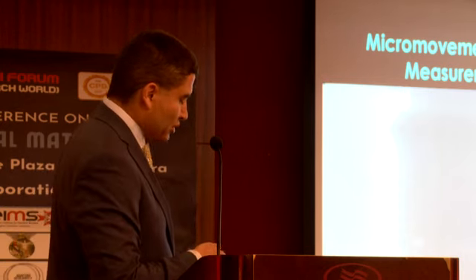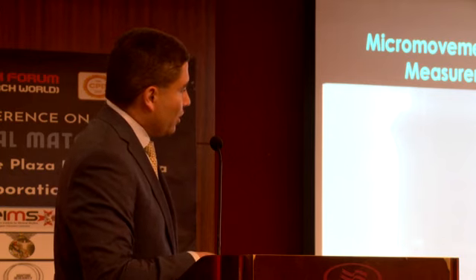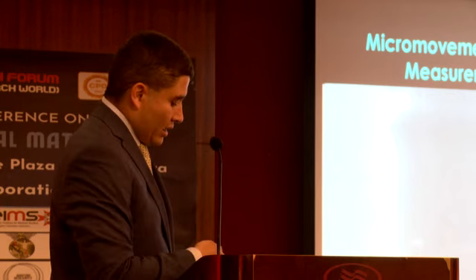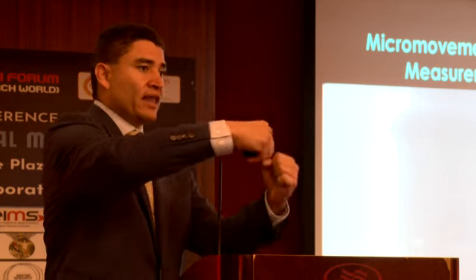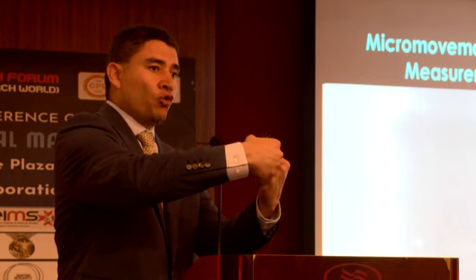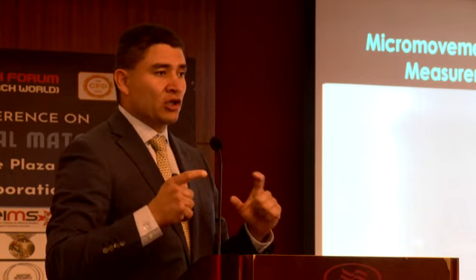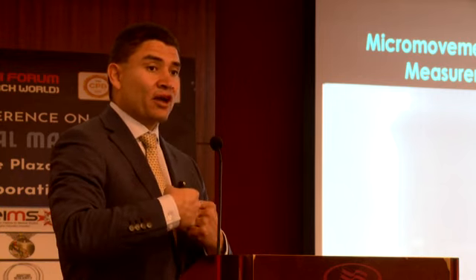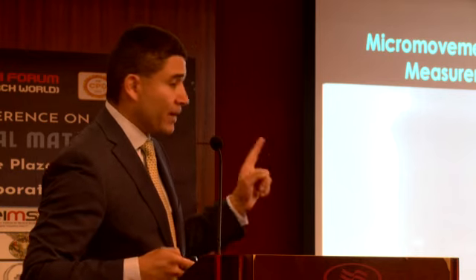Okay, what we will see here when I play the movie is that when the forces of occlusion come and hit the abutment, there is a space or movement that happens at the abutment to implant interface. That's called micro movement, which is suitable for the inflammatory cell infiltrate to go back and forth like a pump inside the micro movement and cause more bone loss. So let me play it and pay attention.